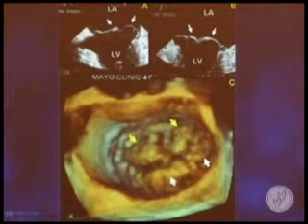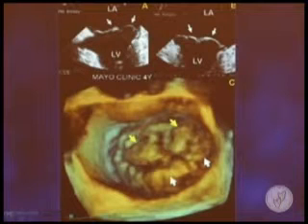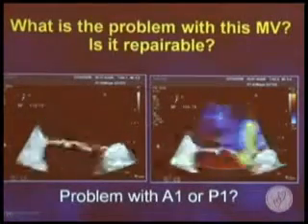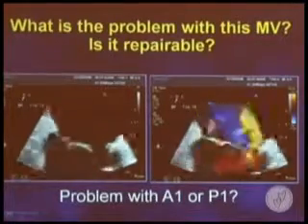And going into the surgery ahead of time, he will have a game plan as to what to do to repair that valve. You can make that diagnosis by 2D, but it takes a higher level of skill than it does by just looking at the valve in the en-face view by 3D TE. Now, one final case, interaction with the audience. Nobody answered my last question, but let's take a vote. You only have 2 choices here. What's wrong with this mitral valve?